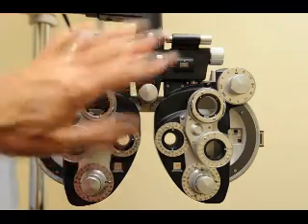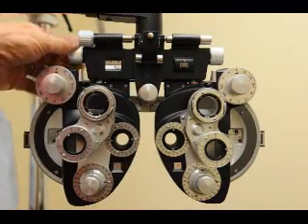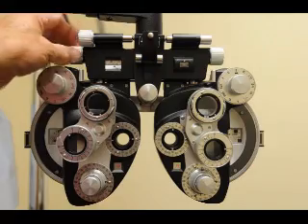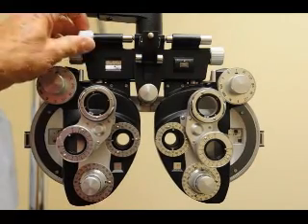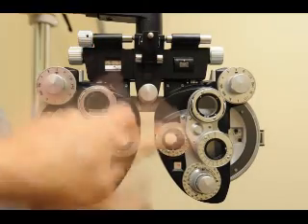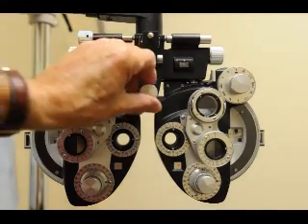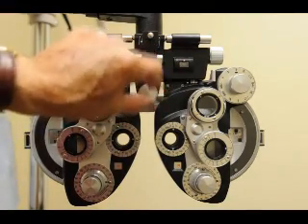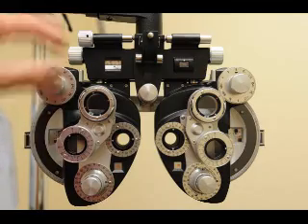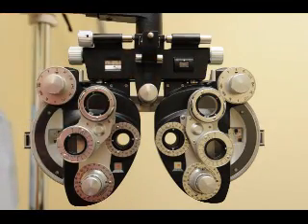Then you put the phoropter in front of the patient. You check the PD by adjusting that knob and look through here to make sure the two eyes are lined up. You do the leveling with this knob here. Once the patient's eyes are in the proper position, you adjust the head position. You can take a pin light and shine it to see where the eyes are — leave the room lights on for that adjustment, then turn them off, but keep enough light to see your dials.